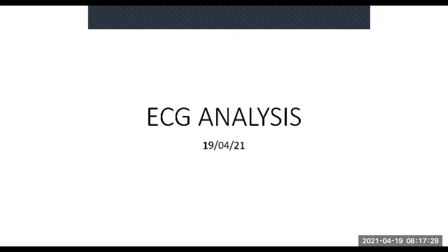All right, guys. So another morning of analyzing ECGs. Tired of it now, I'm sure. Eh? Yeah, you have to. That's the third part. Eh? All right. So today we're going to analyze another one.